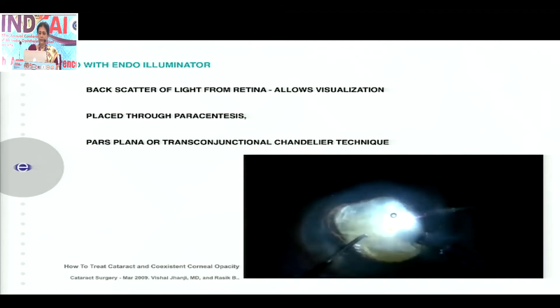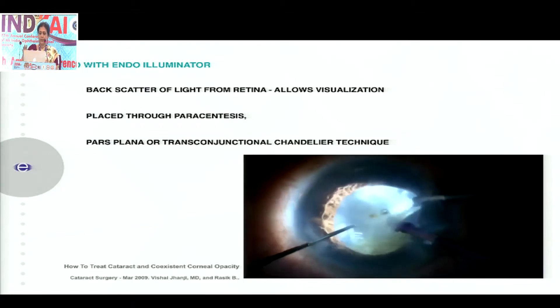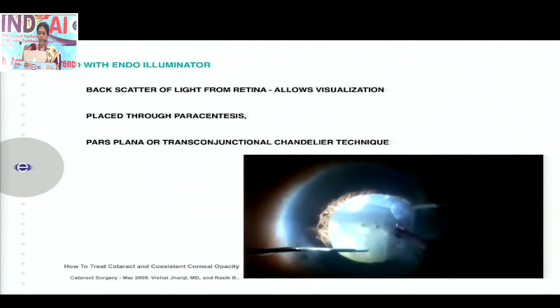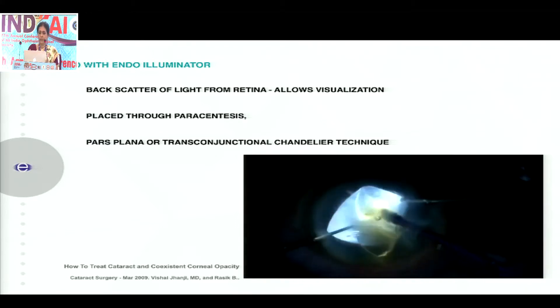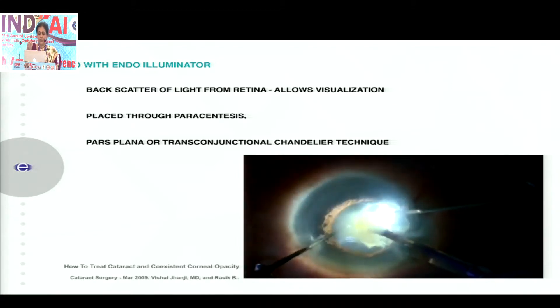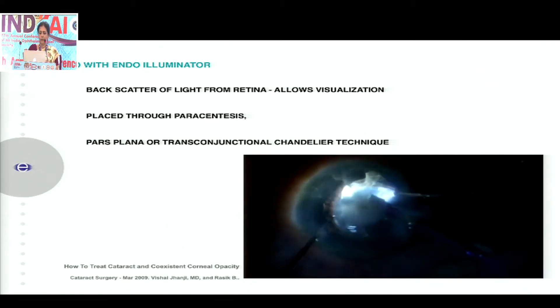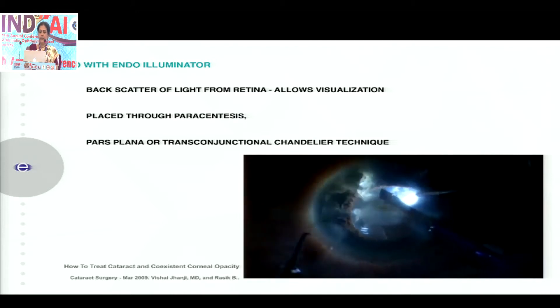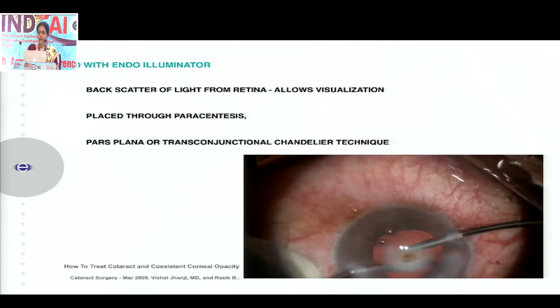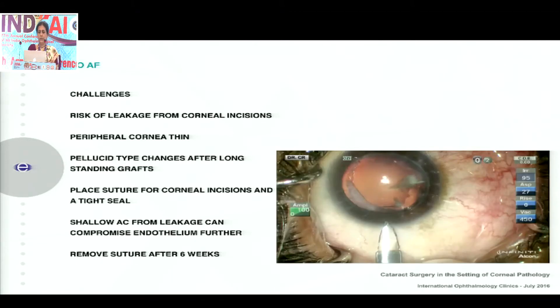It's a barely edited video and you can see the steps go on. The only challenge here is some floppiness in the iris, so you need to bring down your phaco parameters and be prepared to use iris retractors. In this case, a supracapsular phacoemulsification approach is also allowed because it's most important to do safe phaco in these eyes. Endoilluminator usage is of great value in eyes with corneal opacity, and then removing the cortex and placing the IOL bails you out.